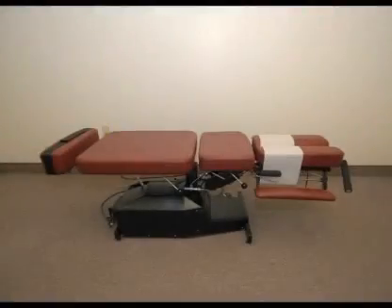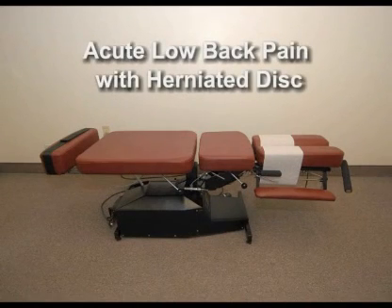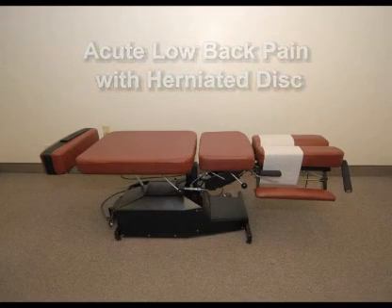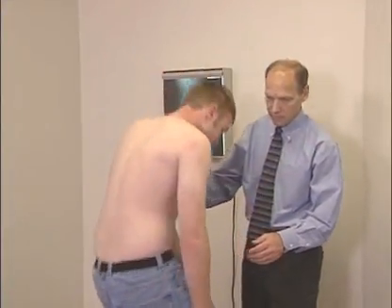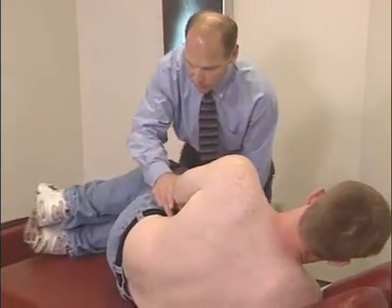One of the most common spinal conditions seen in a chiropractor's office is acute low back pain associated with herniated or bulged disc. The following is an example of how to treat a patient with acute low back pain with a right lateral herniated disc on a motorized flexion distraction table. Have the patient lay on the table with the bulged disc side down to avoid further compression of the disc.